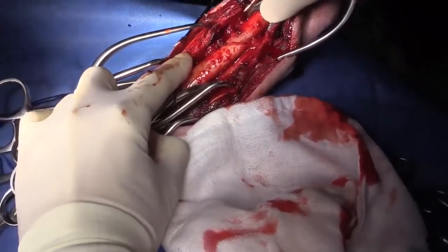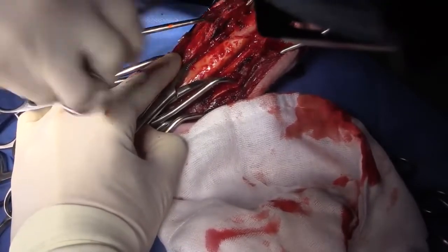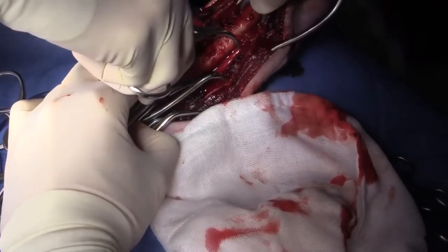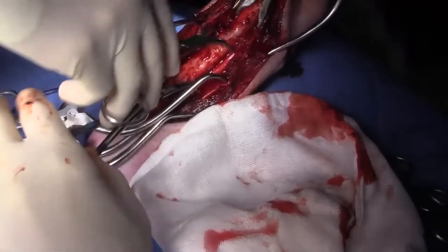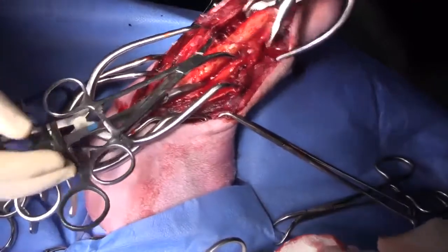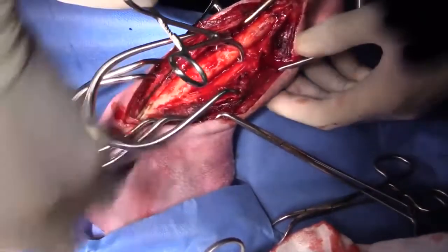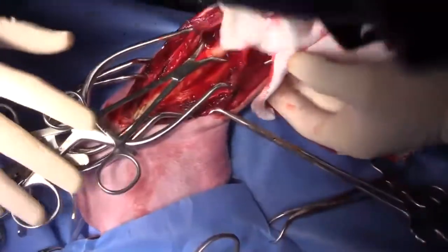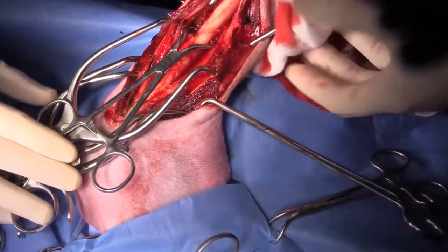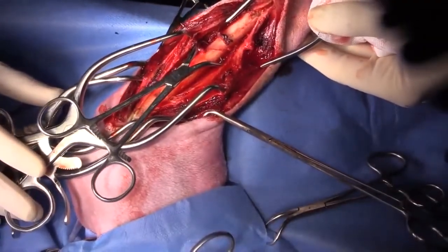Can you go with a pointed reduction forcep right across that fracture there? So that is pretty much perfect right there. Let's get rid of some of these other clamps. I'm pretty happy with our reduction — that fracture is reduced.